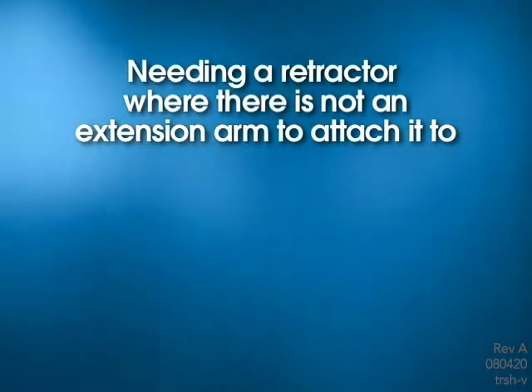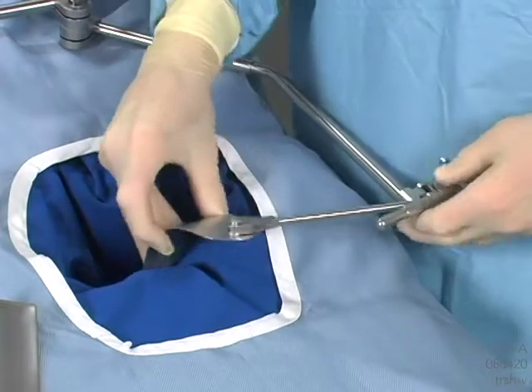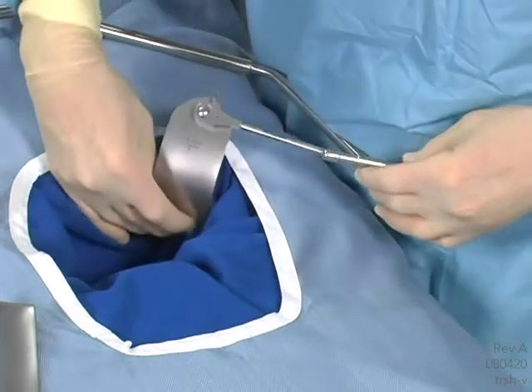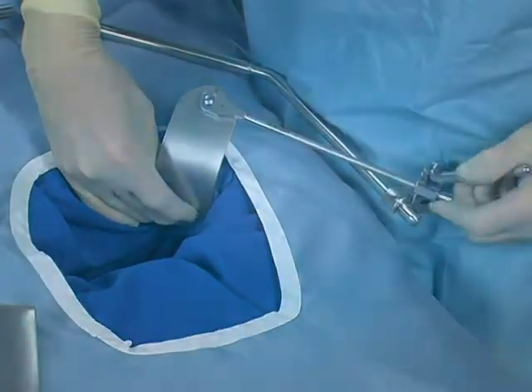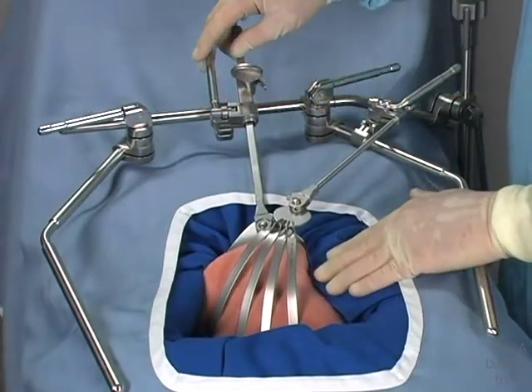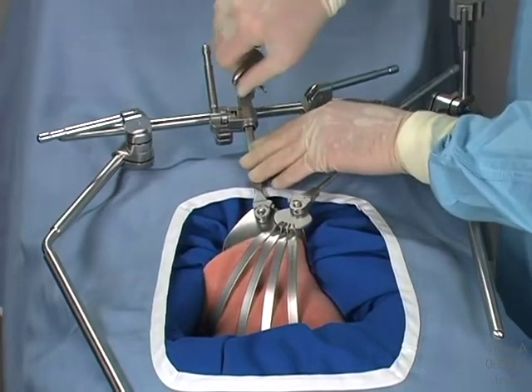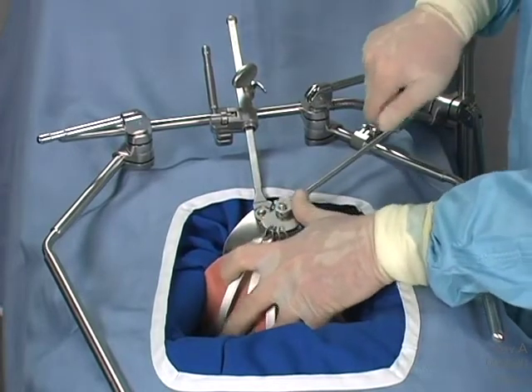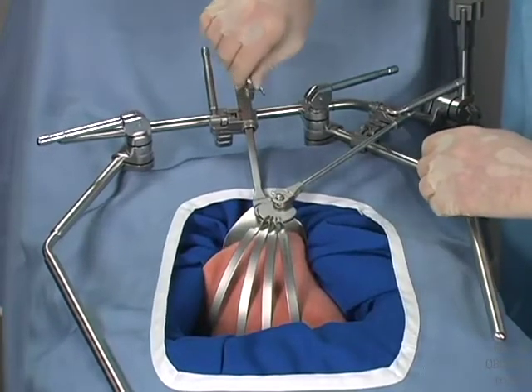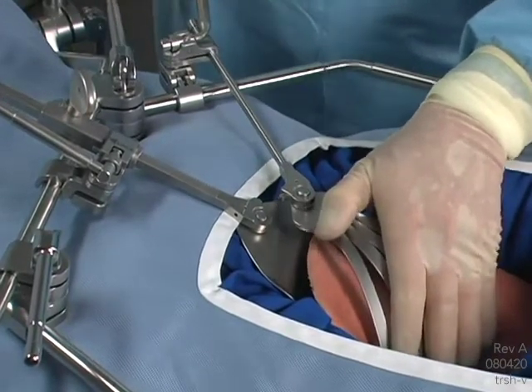Needing a retractor where there is not an extension arm to attach it to. Note that the swiveling blades allow the retractor handles to be positioned out of the team's way. This feature may also be used to place retractors where there are no framing arms. Multiple planes of retraction are needed in the same area. Multiple planes of tissue may be retracted with the Thompson Retractor. Retractors may be placed over each other by utilizing the swivel feature of each handle-blade combination. For example, one retractor may be positioned to retract the wall of the incision, and a second retractor may be added to retract soft tissue in the same area.